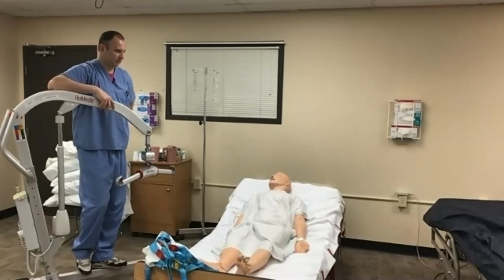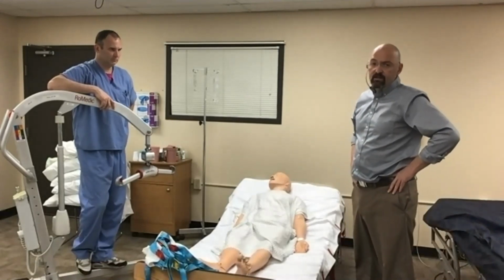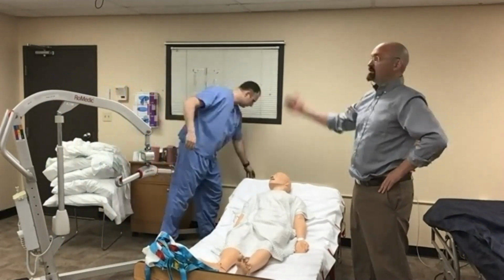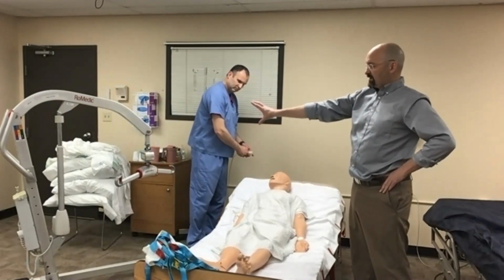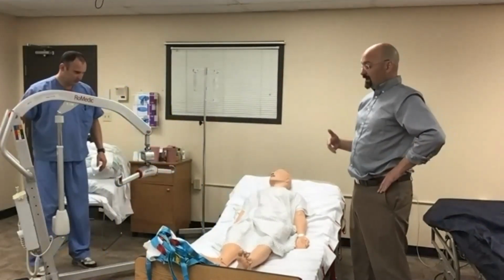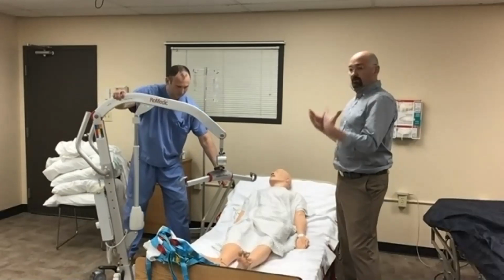So our second opportunity, or our second tool we're going to look at for proning is using a lift system and repositioning sheets. As you'll see, the best thing to have for this scenario is a ceiling lift system because of the height. Because this is as low as the bed goes, we have a scale, and that's as high as this goes. You'll find that you can't get enough height to get that patient completely prone and turned over. Again, we're going from what we consider the best to the better. This is going to be better than other options. And then we're going to look at the rest.